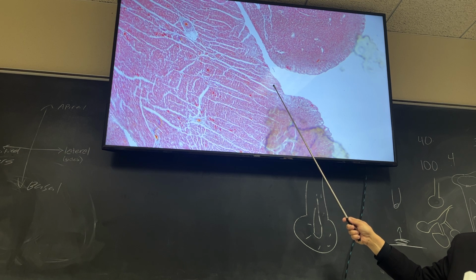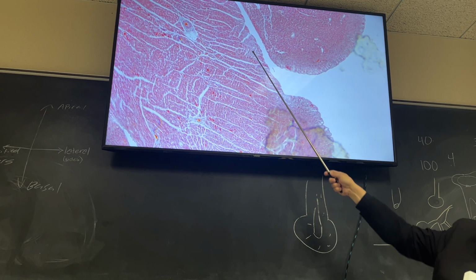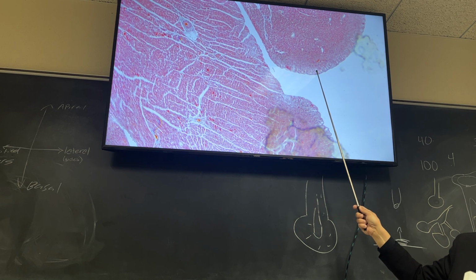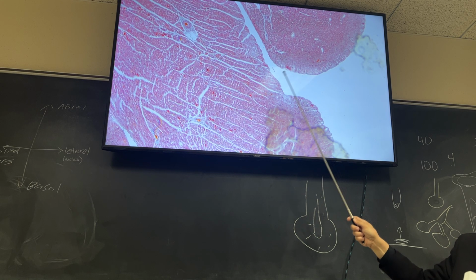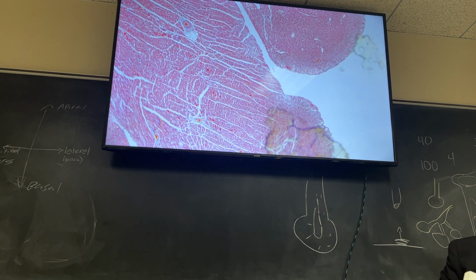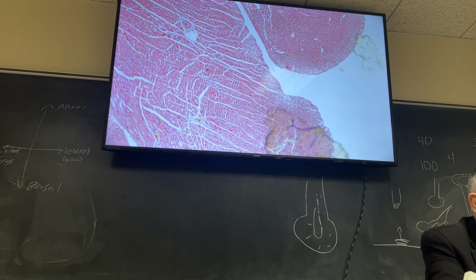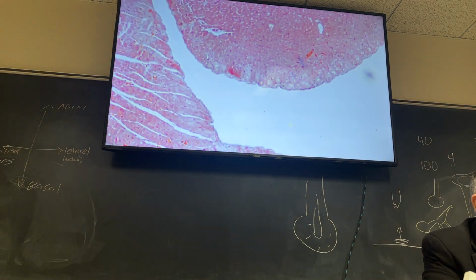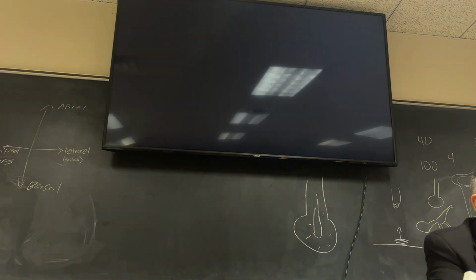I'm going to zoom in to give you a better view, but notice how it looks lighter in shade, and it looks like there are almost gaps in it, right? That's the key distinction, and it usually is on the edges, okay? So let's zoom in on it a little bit. I'm going to zoom in specifically on this area here because it looks really nice.